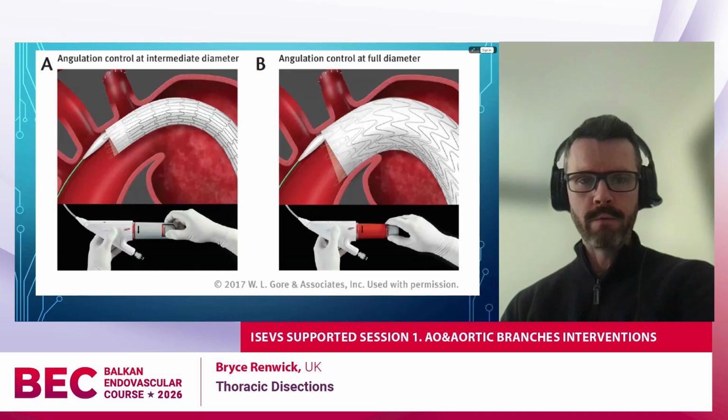I'm sure the audience are very familiar with thoracic aortic stent grafts. We used a Gore C-tag. You can leave these for quite a while undeployed, and then they deploy in 2 stages, which is worth knowing about if you're having to deploy them in a hurry.